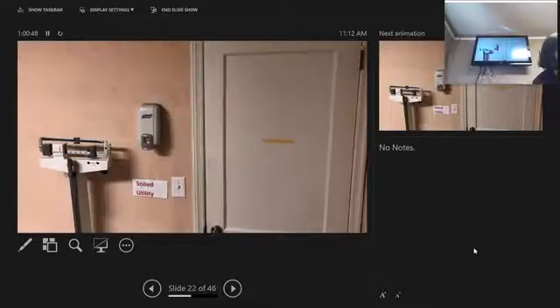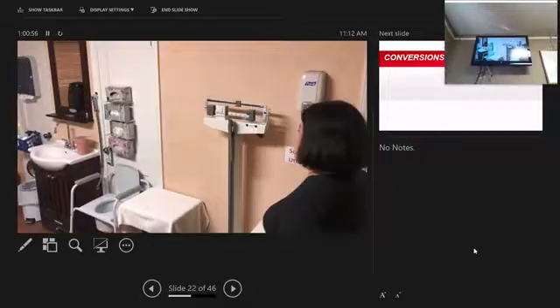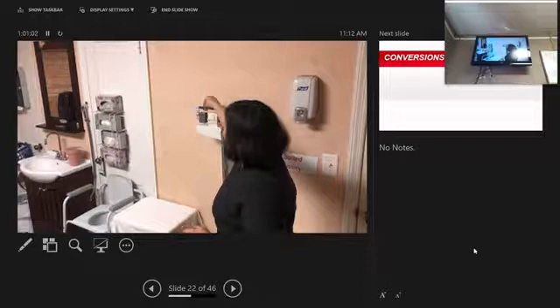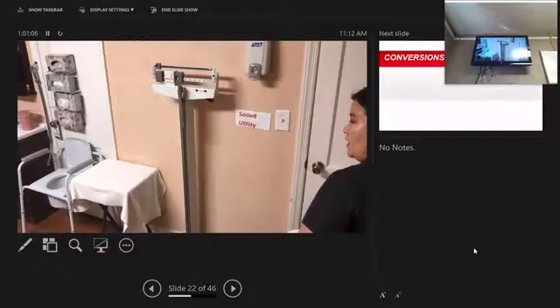All right, so for national testing, this is how you are going to measure weight. Come in. Hello, Mr. Mills. My name is Tanya. I'm your CNA today. We need to get your weight. For this scale, I'm going to go ahead and get my equipment ready. I'm going to zero my scale.